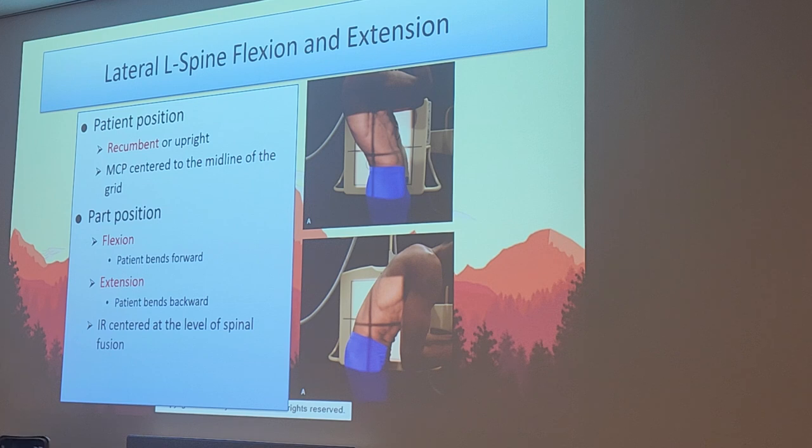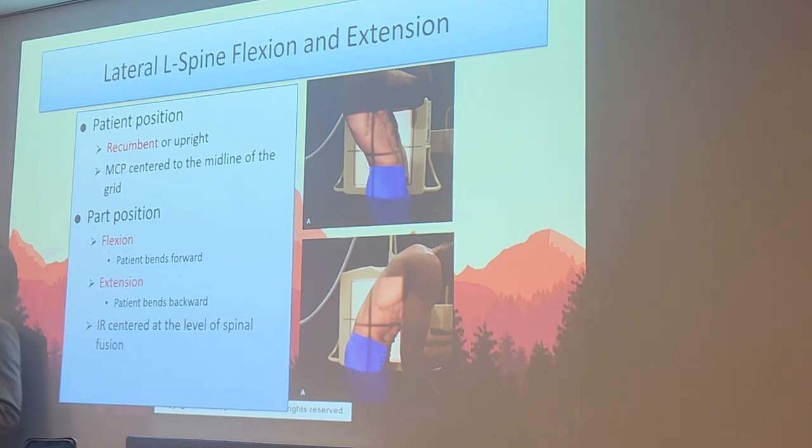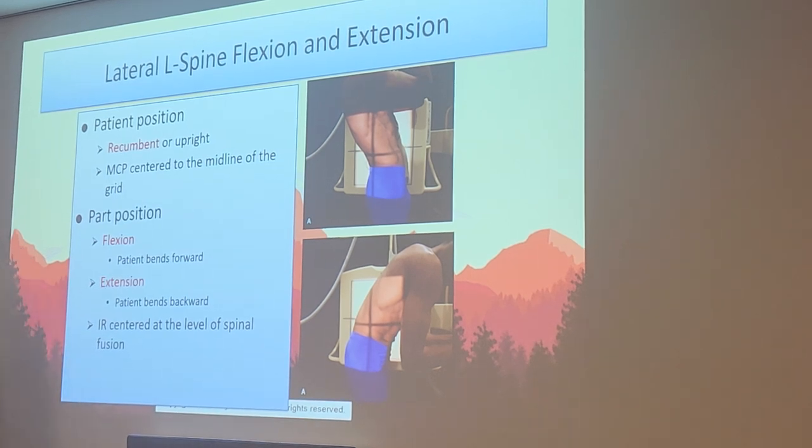That's my extra days. Okay, I've got about 15 more minutes. We'll get to where I want to stop here. Okay, so here we have, once again, don't be confused with the bending views. This is now the flexion and extension views. These are also done mostly to check spinal fusions. And make sure you know the difference per the picture.